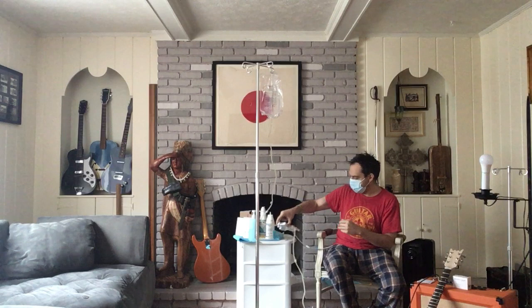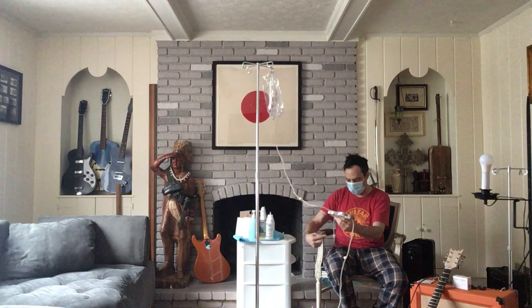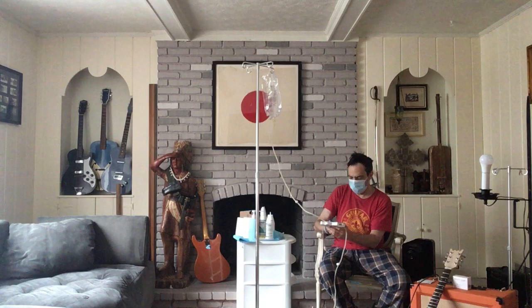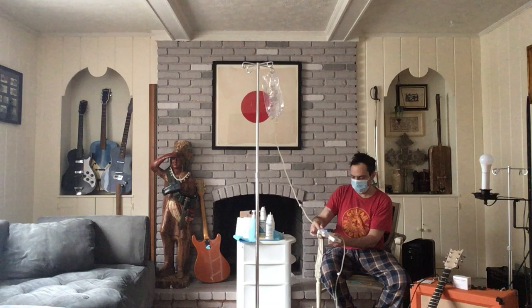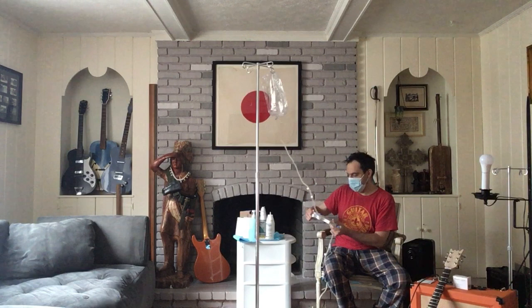The order of operations is I'm going to unplug or turn the dial to close, which inserts a pin, which is going to press into a betadine cap and clean everything up once we're clamped. So this clamp is the last safety measure right here. If all else fails, use the clamp, basically. So turn that. Clamp, okay, slightly disengage the cap, slightly disengage the catheter port, pull this part off, and screw that into the other part of the safety cap, and there you have it, you're done. Take your old piece and screw it back onto the port.